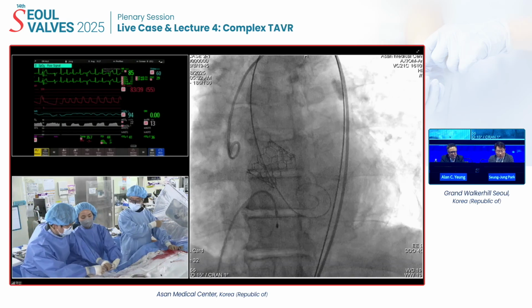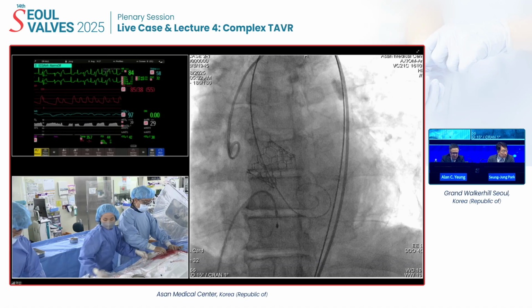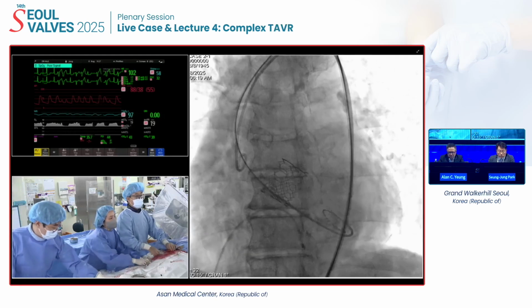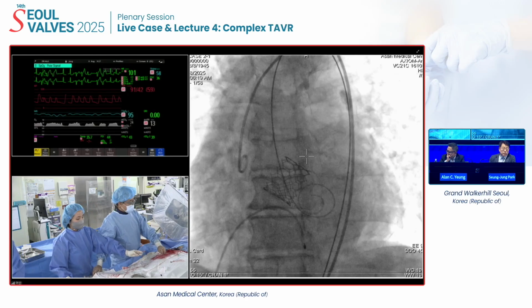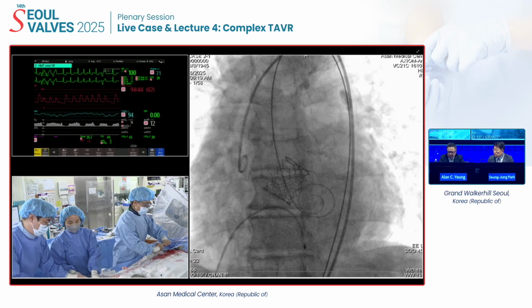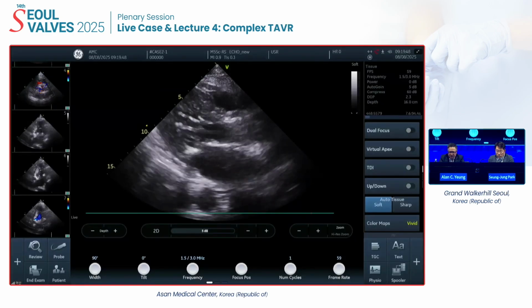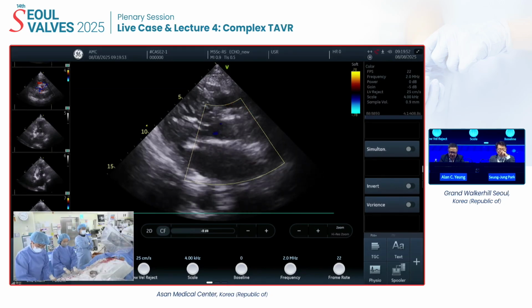Now check the echo. Go quickly to the echo. This overfill made more foreshortening on insertion of the pigtail into the LV. Okay, wait a moment. Measure the pressure, look at the echo, and then let's try. The amount of oversizing depends on who is inflating the device as well. At the end of the day, whether you go to nominal or plus 2 cc depends on how hard you squeeze. Sometimes it may not be possible. It's a combination. If the valve is not that calcified, you can easily get to plus 2 cc.